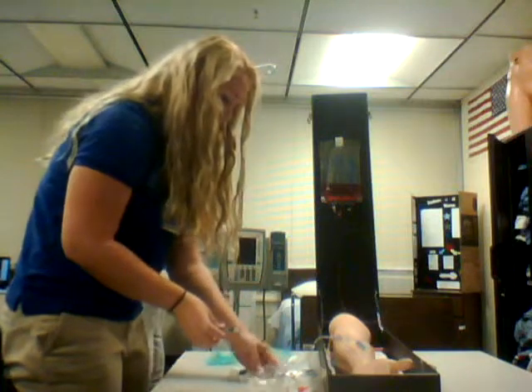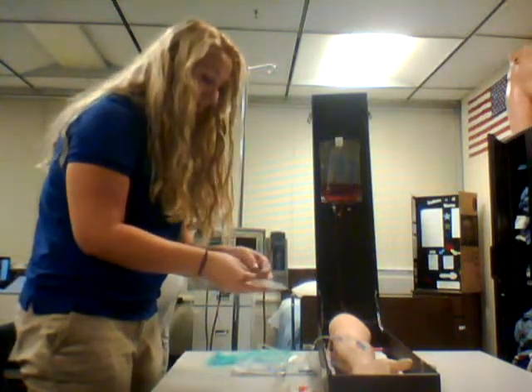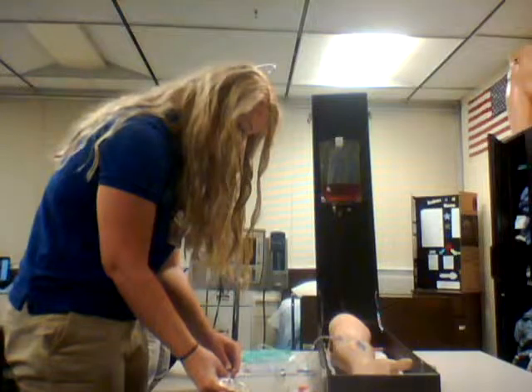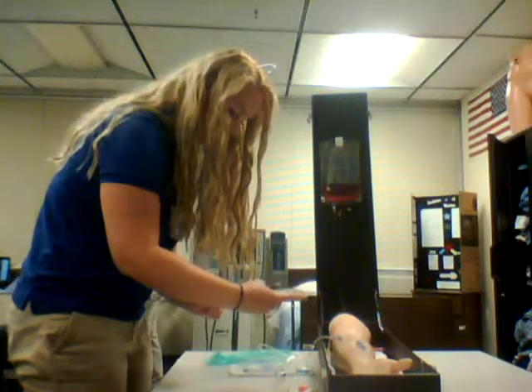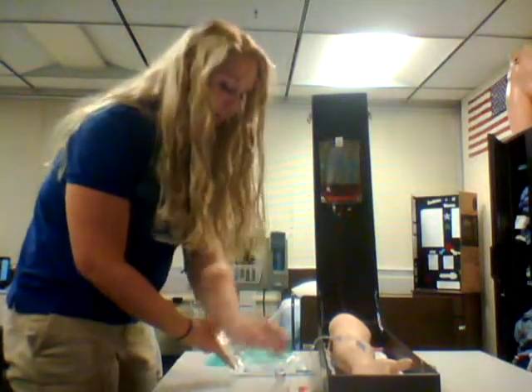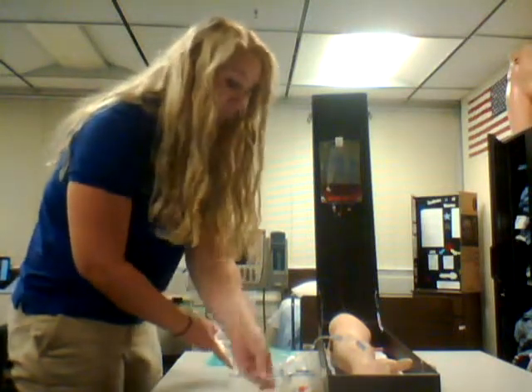Okay, so then I'm going to take my bag, and I'm going to insert the medication into my bag. But first, I'm going to discard this into my sharps container. First, I would have cleaned the port before inserting the medication.